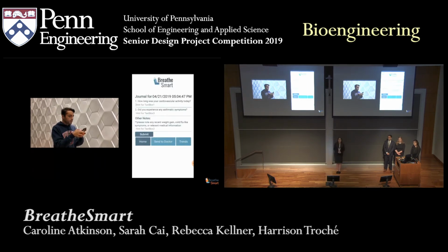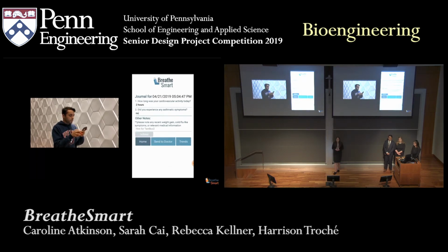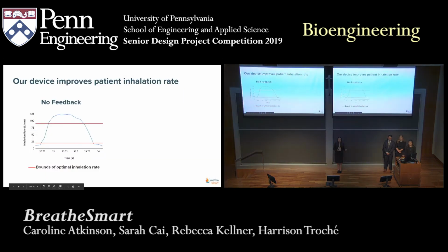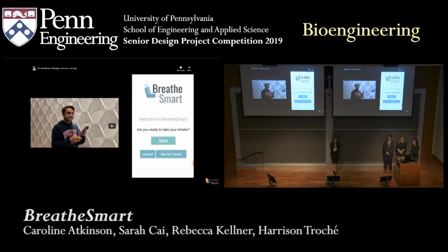The next thing that we did was we spoke to doctors about what would be useful information to store. Besides the flow rates, we created this survey or journal through speaking to doctors that allowed the patient to enter things like the amount of cardiovascular activity, how they were feeling, stored the location in which they took the inhaler, has the potential to store the weather, the pollen count, and if you see on our CR trends, at the bottom there's the CR trends note, that allows them to look at both their inhalation and exhalation rates in reference to the pollen count, the weather, etc.